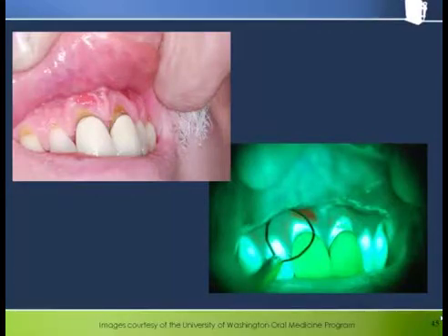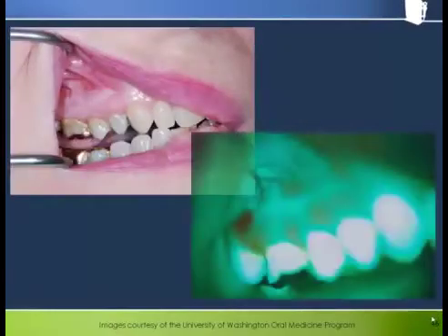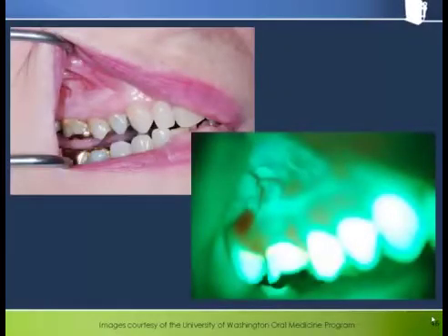Here is a troublesome looking area on the attached gingiva that has an intense loss of fluorescence through the VELscope. The red-orange hue to the color may be indicative of some bacterial presence there. The area was found to be dysplastic on biopsy. It can be seen in this example that it is the dentin that gives rise to the intense fluorescence from the teeth.